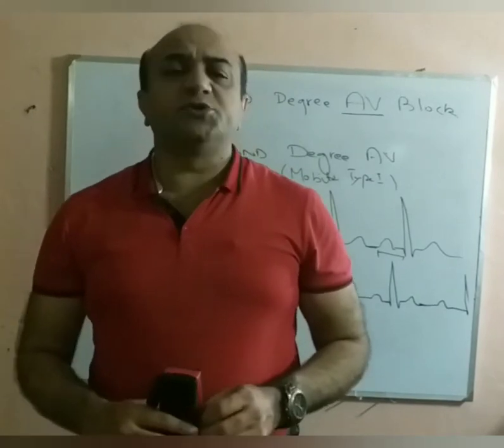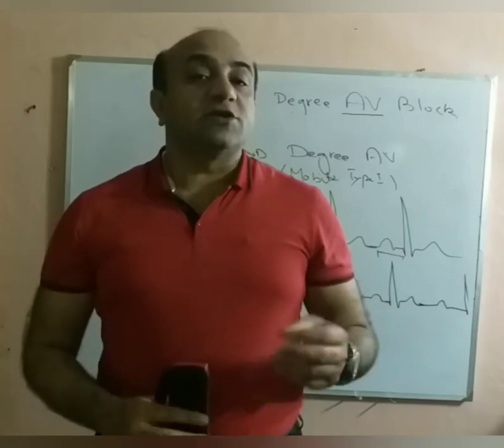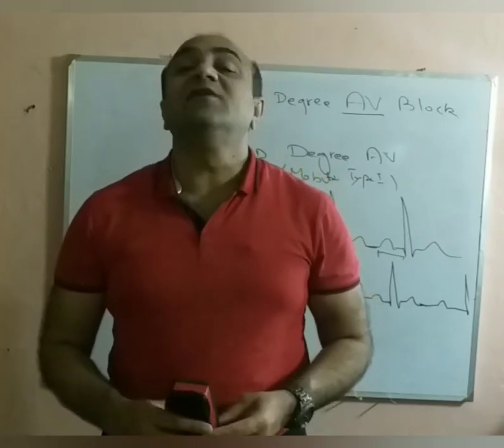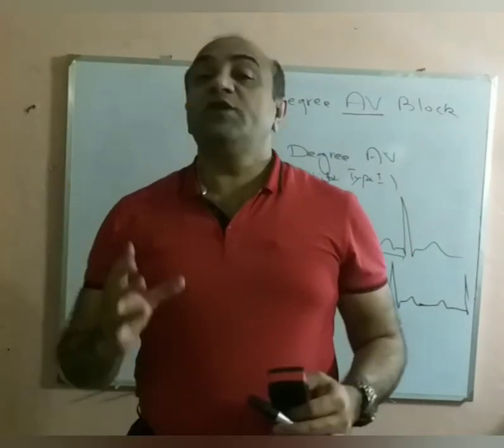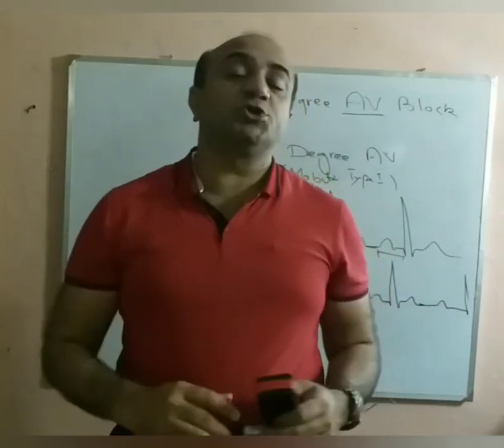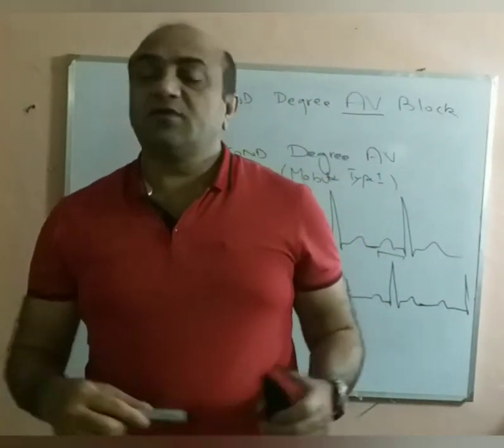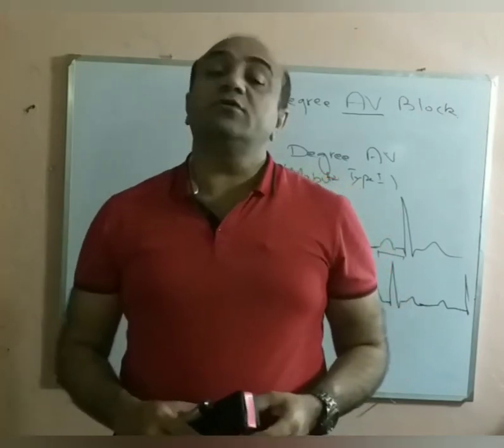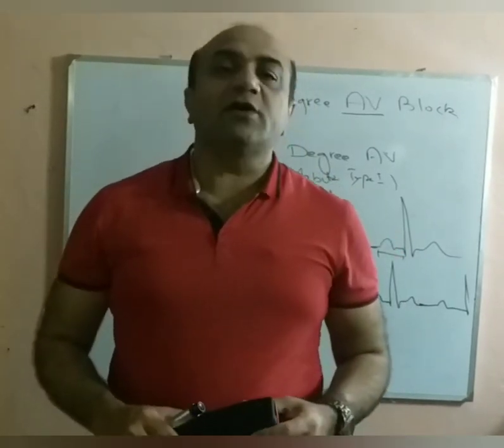So most of the time these patients are not in a critical state, but diagnosing type 1 second degree AV block or the Wenckebach phenomenon on the ECG is important because it may be associated with myocarditis, with inferior wall myocardial infarction, with degenerative heart disease, especially degeneration of the AV node, any fibrotic disease of the AV node, sarcoidosis, etc. It may be associated with certain drugs. So it is always very important to diagnose second degree Mobitz type 1, also known as the Wenckebach phenomenon.